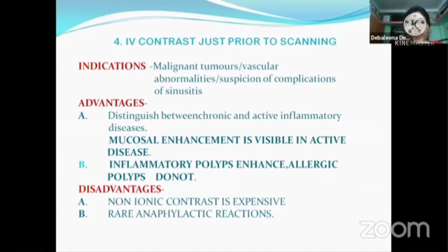Now, IV contrast is given just prior to scanning only in a few indications, where we suspect the tumor to be malignant, any vascular abnormalities, or we are suspicious of any complications of sinusitis.